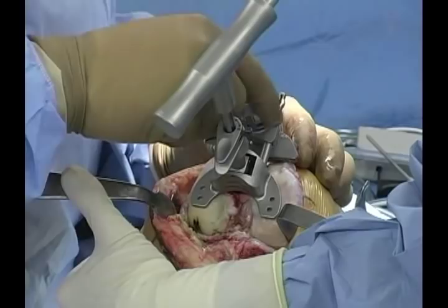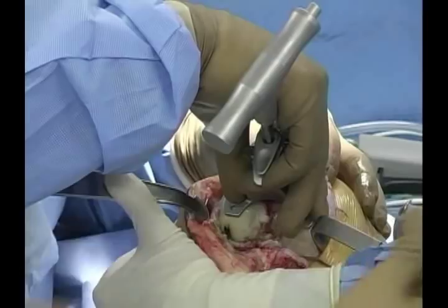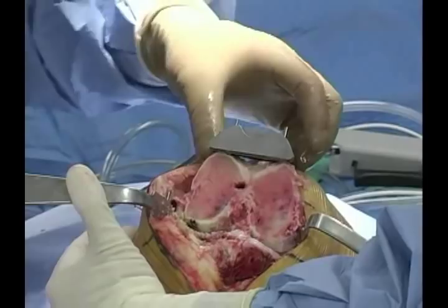We have two types of pins for fixation. On blocks where I may want to move the block, I use just a drill bit for simple extraction of the block. There's also a cross pin that can be used if necessary to help fix the block to the bone. The block is low profile, and the capture for the blade is beveled, allowing for divergence of the blade to complete the cut.